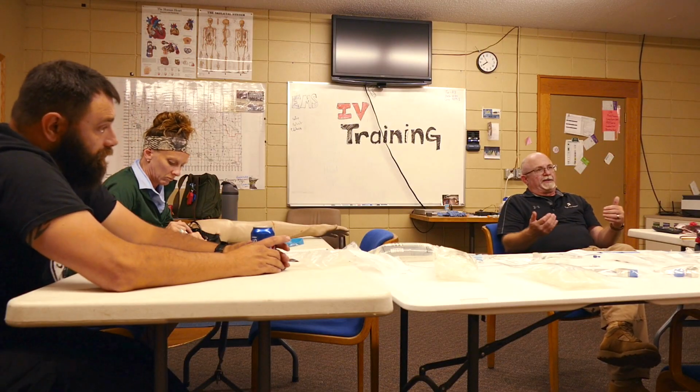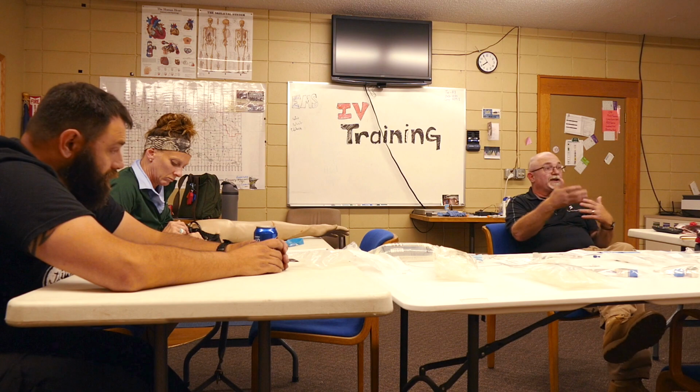More often I've seen that, especially in the backs of hands, when they're very tiny veins and they're fragile and you don't want them to move anymore, you could do almost like a wrist splint where you put the gauze in their hand, put a small board splint and kind of wrap it up, leaving the part where the catheter is in right around so you can see for swelling. Sometimes that'll work. Pediatric patients that are picking and moving, that might also be a solution for you. For the number that you're going to be doing and the patient load that you're going to have, it's probably not worth worrying about. It's something to consider, but somewhere along here, occasionally you'll find some up in here, but hand and AC are going to be your go-tos.